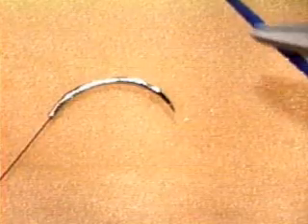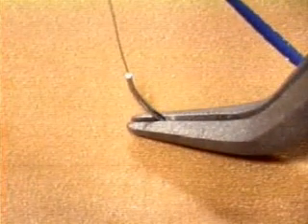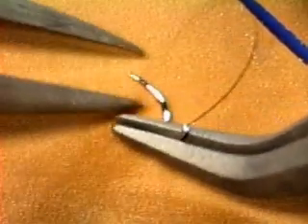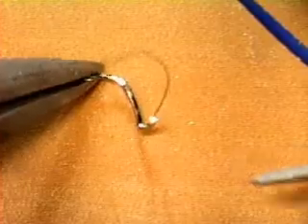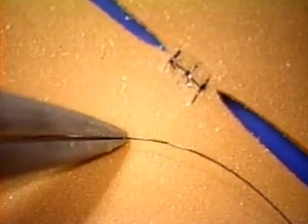Here are a couple of mistakes to avoid in picking up the needle. The first, as I've mentioned, is to come at the needle first with the needle holder. That usually leads to quite an unsatisfactory pickup. The second mistake is to try to correct such a malrotation by working on the needle with both pairs of forceps at once. That tends to make a bad situation worse, and you can end up with your patience diminished and your needle sadly modified.